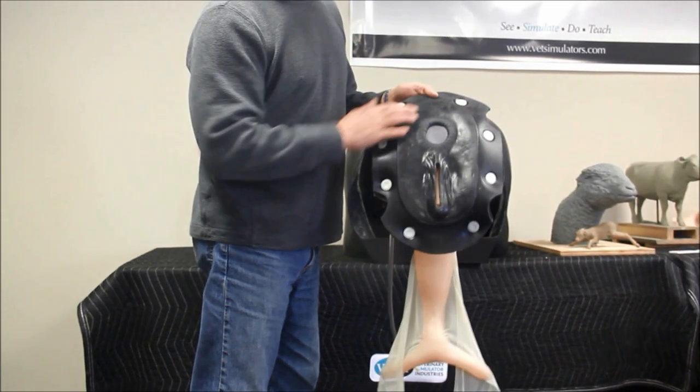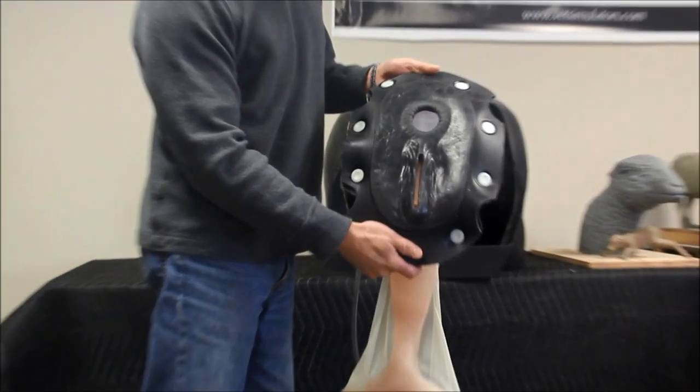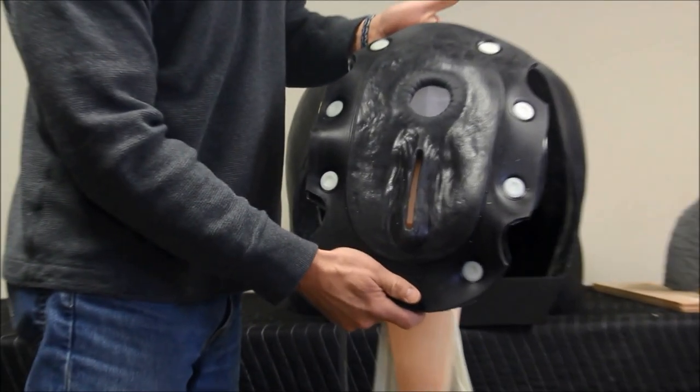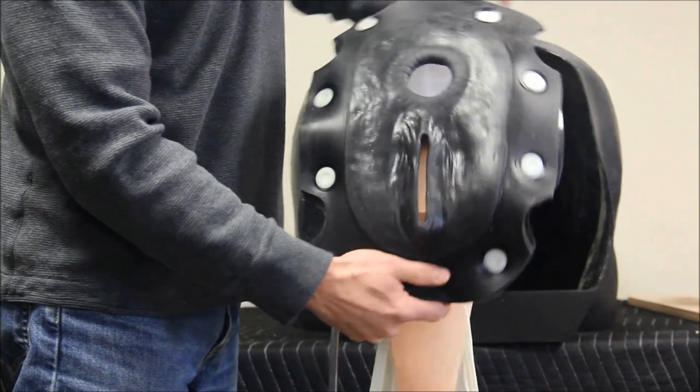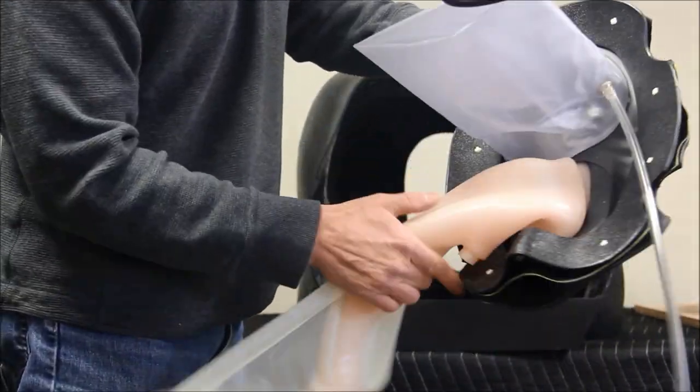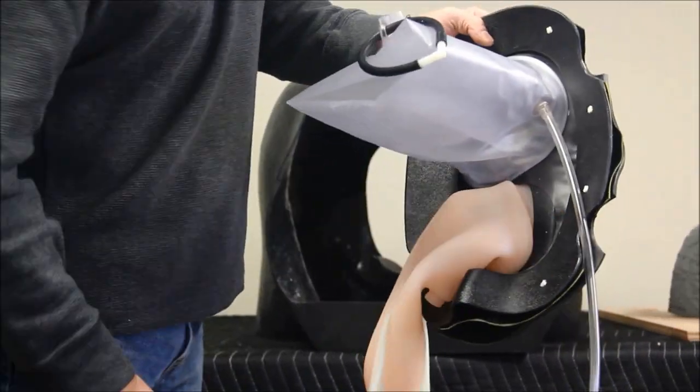This is the equine palpation assembly, which is a replaceable part. It features a soft perineum panel with anal and vulva openings, mounted to an ABS plastic ring via plastic fasteners.